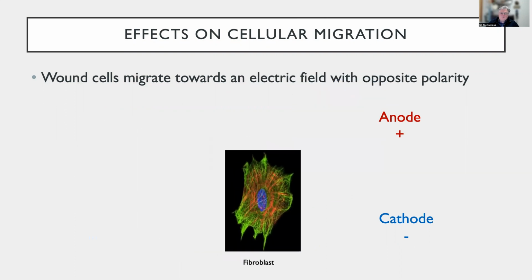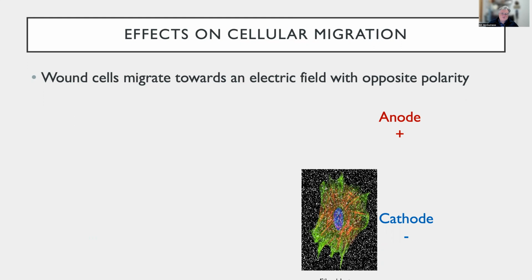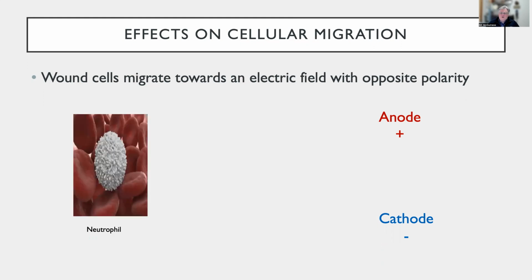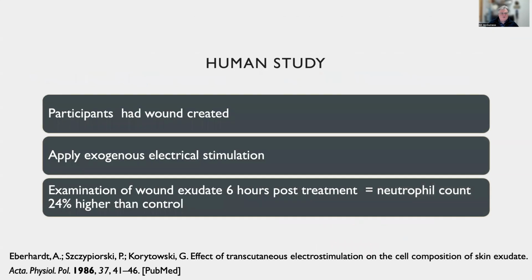Fibroblasts, on the other hand, tend to move towards the cathode, or what's traditionally negative, not exactly, but we'll think about it for this presentation. So if you were wanting to stimulate particular cell types, such as can we get some immune response to an obviously badly infected wound, it may well be that we select machines that will attract more of the macrophages. Equally, if we've got a slow to heal wound, it might be that we attract more fibroblasts by using this electrical stimulation and changing the polarity. Things like neutrophils, we know, tend to be non-binary, and they will go to both positive and negative poles. So there seems to be some evidence that by using electrical stimulation, we can start to be selective in terms of activities within the actual wound itself.